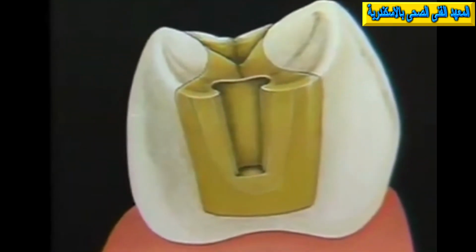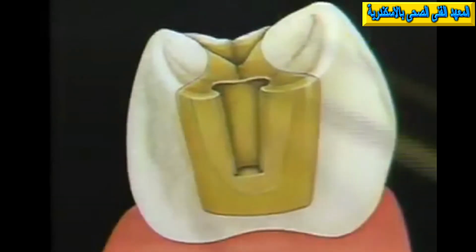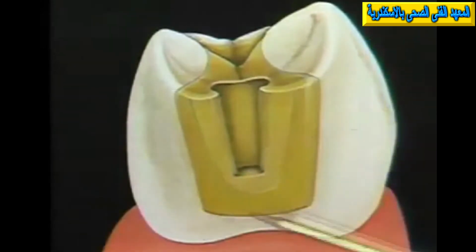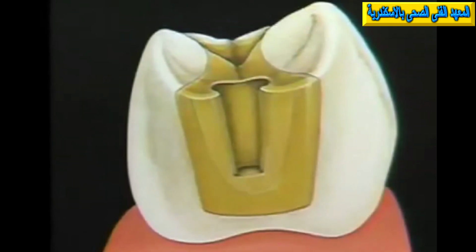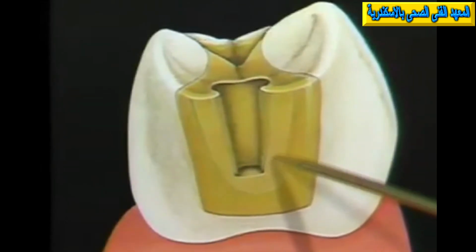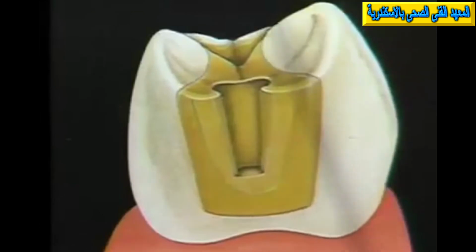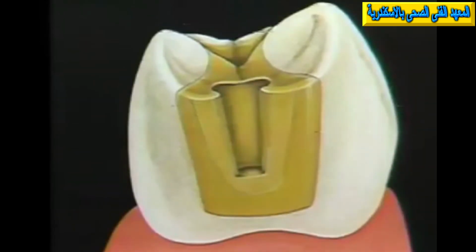The rest of the bridge is fabricated, and as the pontic, which lies just in this situation, is waxed, an extension is waxed into this keyway. It's necessary, of course, to lubricate the gold in the normal manner, and when the pontic is completely waxed and sprued, it's removed along with the key from the keyway and cast in gold.